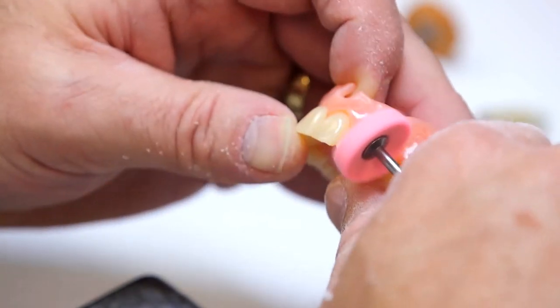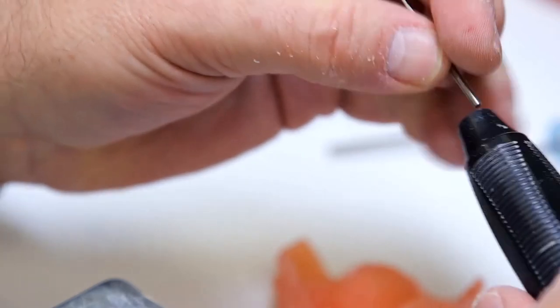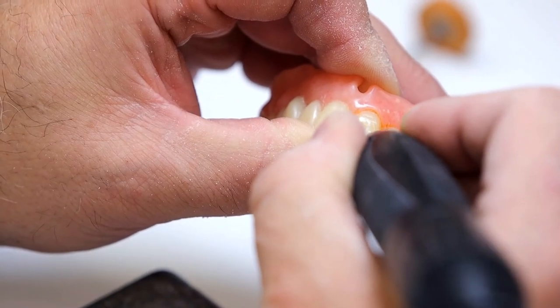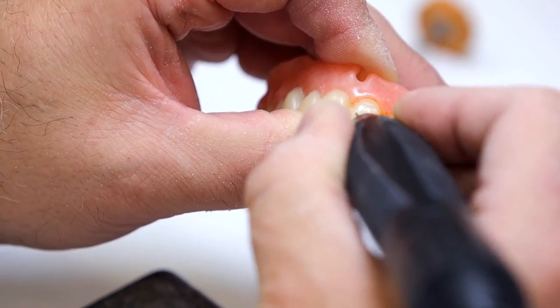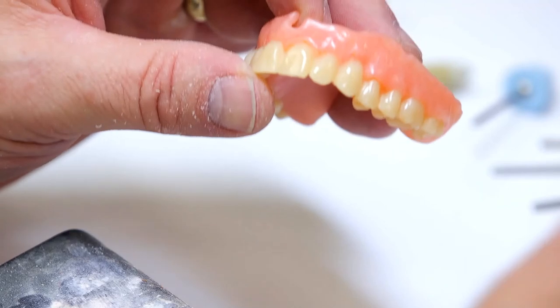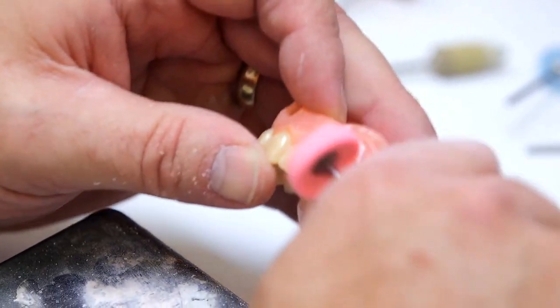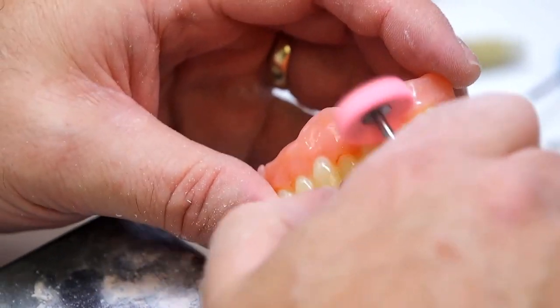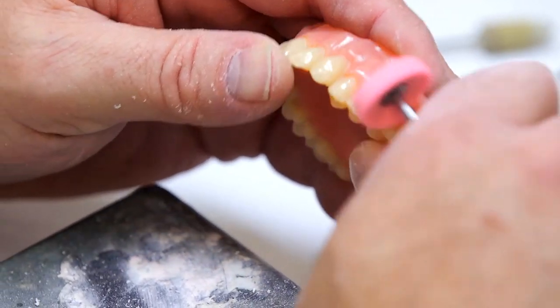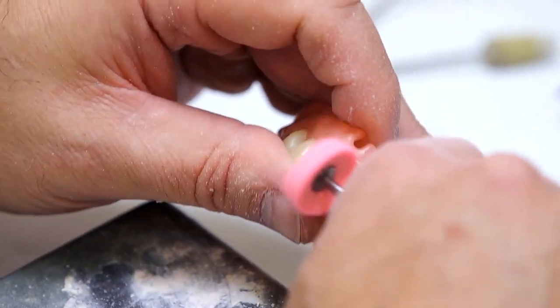As I go over this surface, if we want to talk about that good, better, best denture again, this is a good denture. If I want to make it a little better, I can always come in with that number 2 burr. So you can add a little bit more surface texture to this tooth. We can see how a little bit of surface texture begins to change the light, just as it does on a ceramic tooth or a nice Phonares or Vivident SDCL or PE tooth that has some really nice anatomy. And it doesn't take long to put that back on there. Real quick, just over it with this pink wheel.